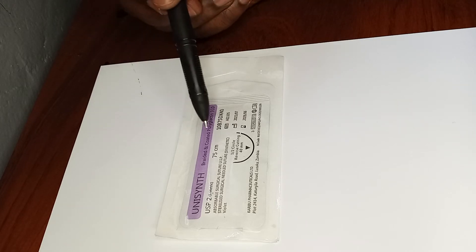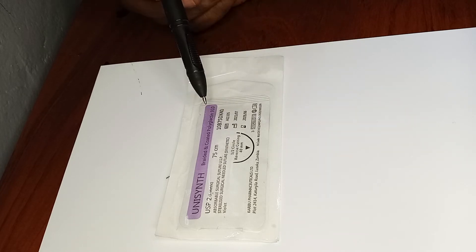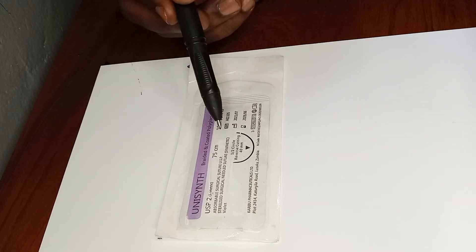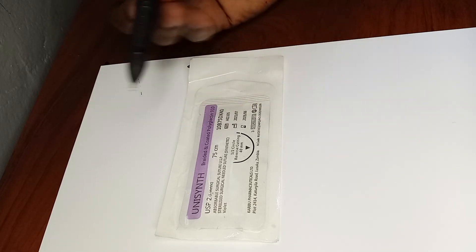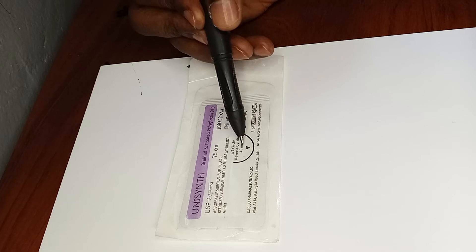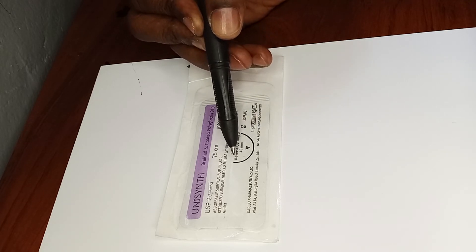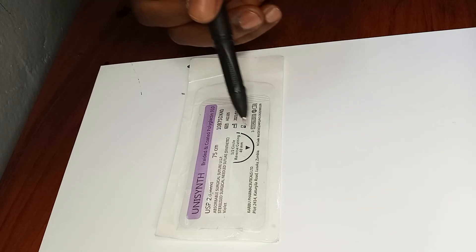This Vicryl suture has a half-circle needle that is reverse cutting, which is less traumatic than a cutting needle. So in a place where you don't want too much trauma but want to suture easily, this is the needle to use. The length of the needle from tip to the other end is about four centimeters, which is shorter than the chromic catgut needle we looked at.